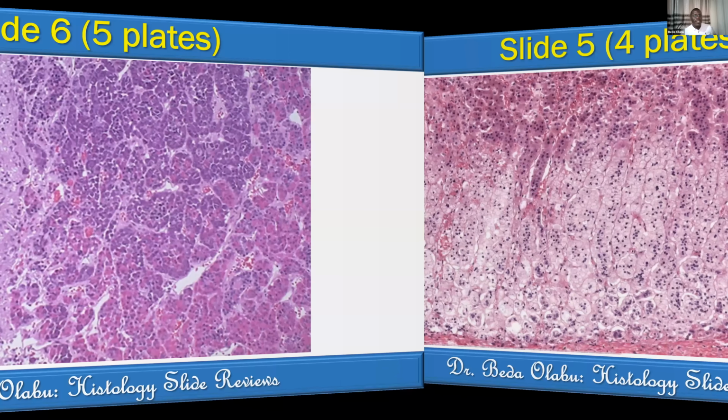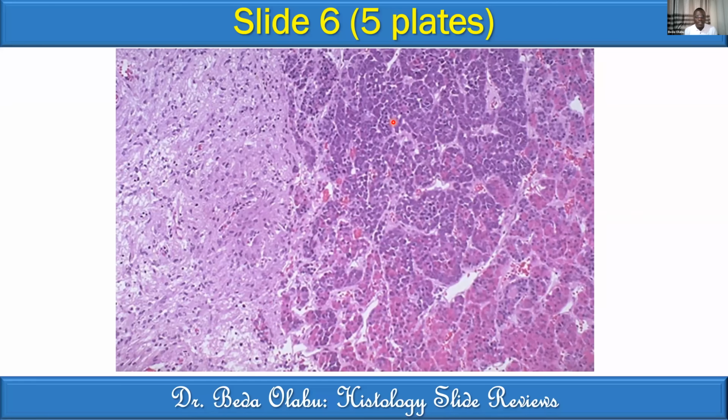All right, this is another slide for you. This one will require that you think deeper. I'll only give you that level of magnification though. I want a description on that level. So just describe what you see. Then tell me what you think it is. Then I'll pick it from there. So I'm only giving you that magnification. Any volunteer, what do you see? Describe it, and what do you think?